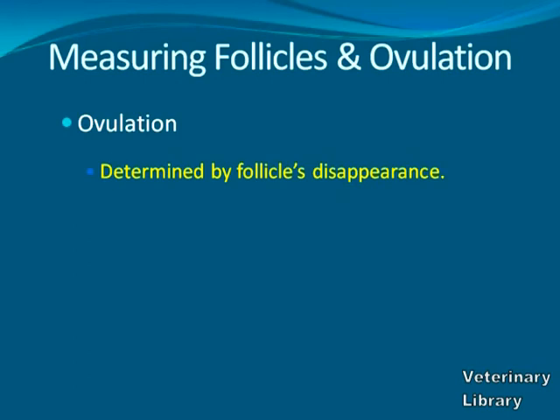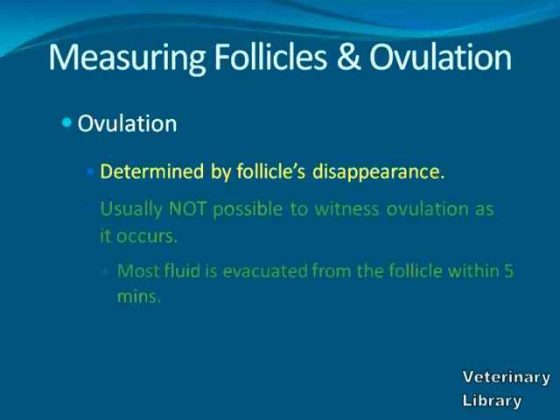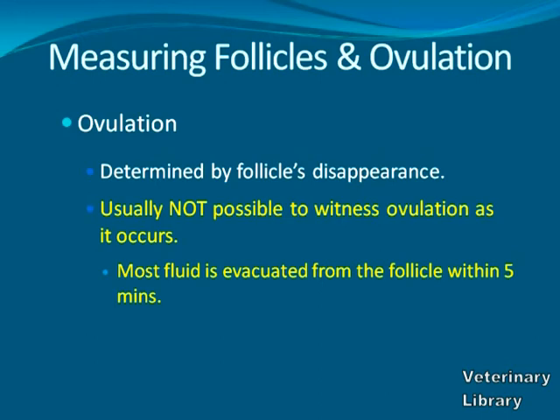Ovulation is determined by a follicle's disappearance. It is usually not possible to witness ovulation as it occurs because most fluid is evacuated from the follicle within 5 minutes. You would need to ultrasound a mare at 5-minute intervals in order to observe ovulation.